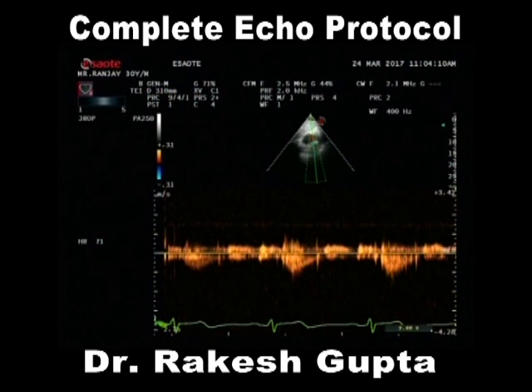And if you look at a watch, it took me almost 30 minutes, 32 minutes to complete my complete echocardiographic study. And once we have done this, fortunately these machines have a very good setup where you can store all your AVI clips. You go back, reanalyze and then make a diagnosis, and if any discrepancy is there, you can consult any one of your colleagues over there, or you can download it and send it by email to us, and we will reply. But provided adequate imaging is present so that we are able to make some diagnosis and some other findings.